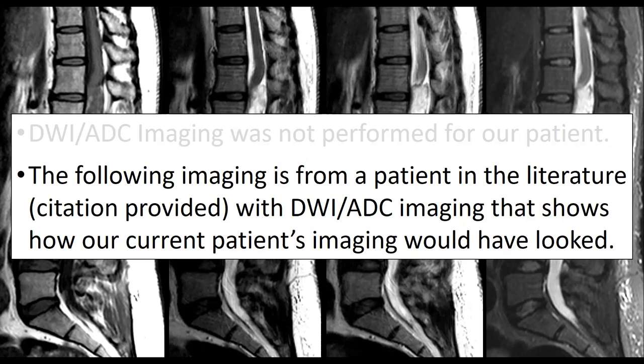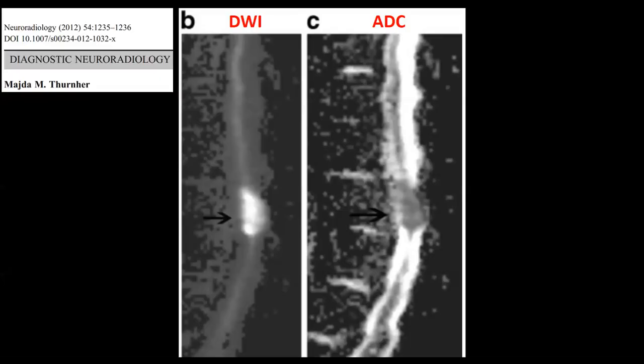Okay, and it will become clear why as we proceed through the case. All right, here it is. You can see this Neuroradiology 2012 by Dr. Thurner. All right, and there's the DWI ADC. Our patient's DWI ADC would have looked exactly like this.